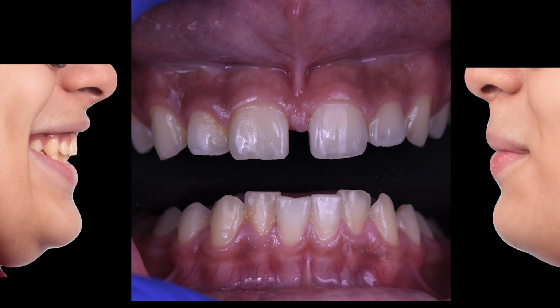That indicates removal during orthodontic therapy to prevent relapse and to prevent compression after closure of the space. In the lower incisor crowding, focus on the incisal edges and the gingival line of the lower incisors. During treatment, you can see the remodeling of the gingival tissues during leveling and alignment.